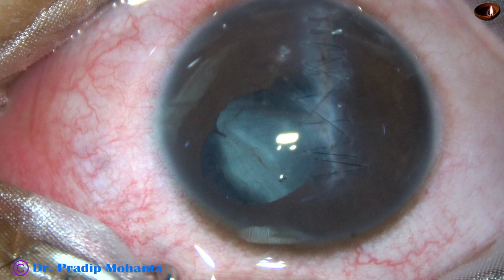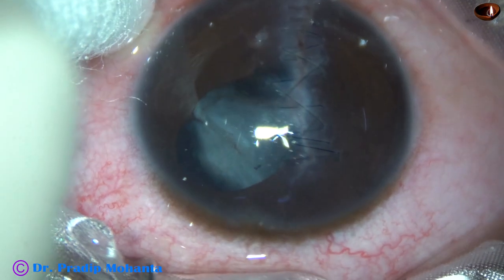This is a traumatic cataract. The patient is a 10-year-old boy. The patient came to me about three weeks ago with a perforating corneal injury. I did the corneal repair, and now after three weeks, I have taken out this case for cataract surgery. The patient is a brave boy.